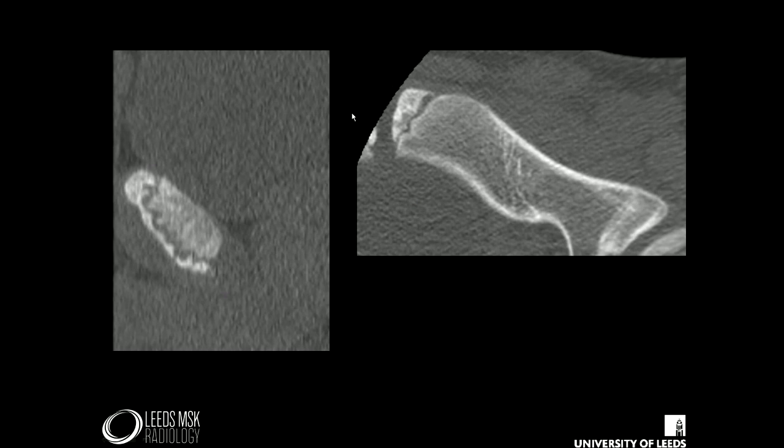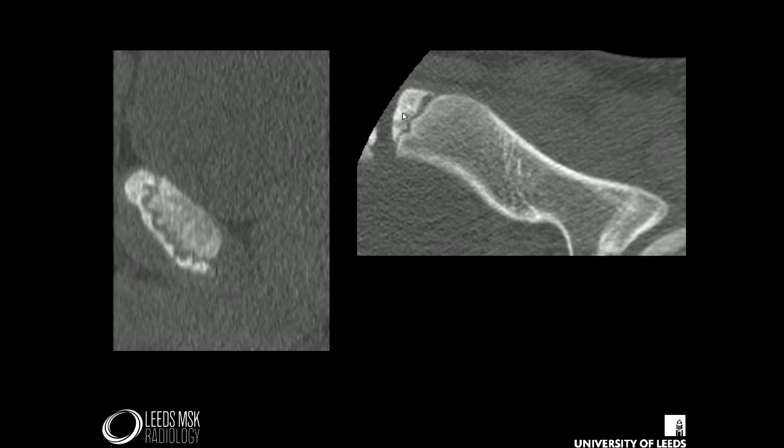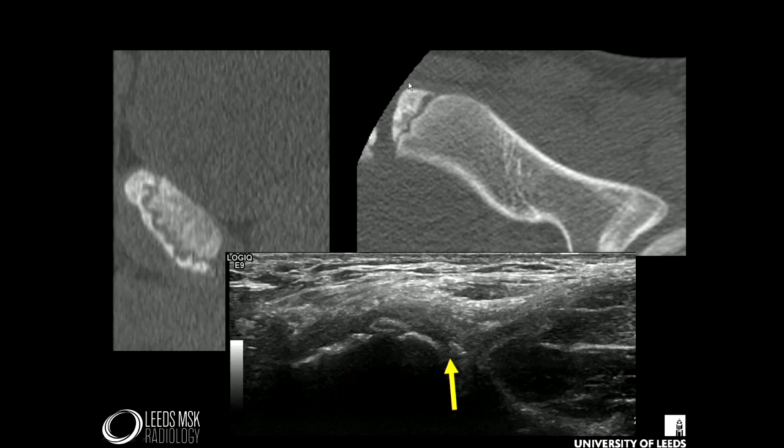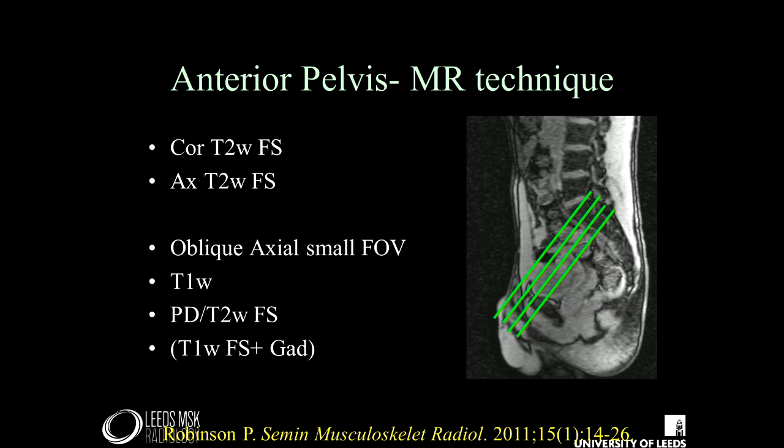You can see it on CT scan — these are taken from trauma scans, so these are incidental findings. This is normal. You can see the way the apophysis interdigitates with the normal body of the pubis and sits anteromedially. On ultrasound, you've got to be careful because this irregularity — which is totally normal because of incomplete ossification — can look very irregular. This isn't an avulsion; this is just normal endochondral ossification.